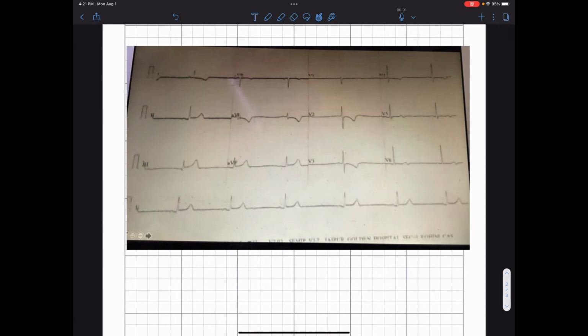See the real life ECG. Now here there is a very small wave, which is the first wave, which is coming in almost all the leads which we can see. So this is called the P wave. It's a small thing. It's about 2.5 millimeter broad and 2.5 millimeter tall. That's the maximum limit. This is followed by a complex which is known as the QRS complex.